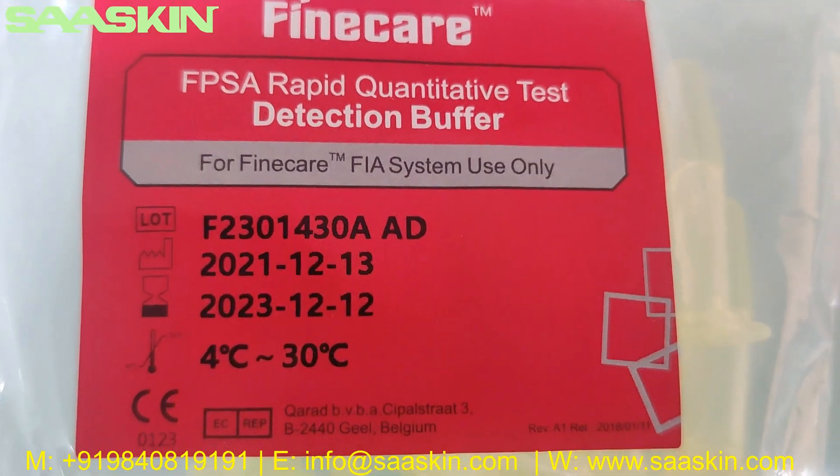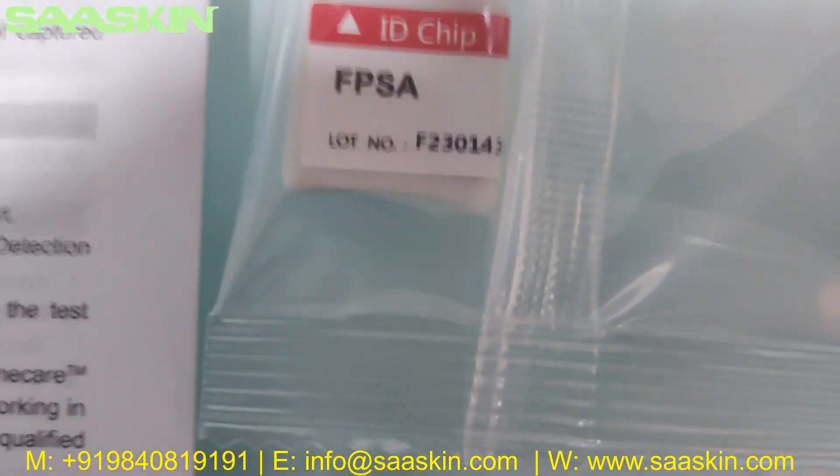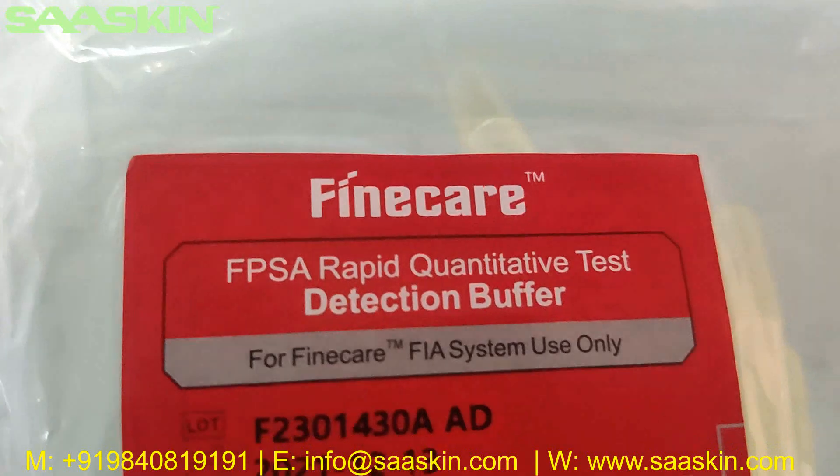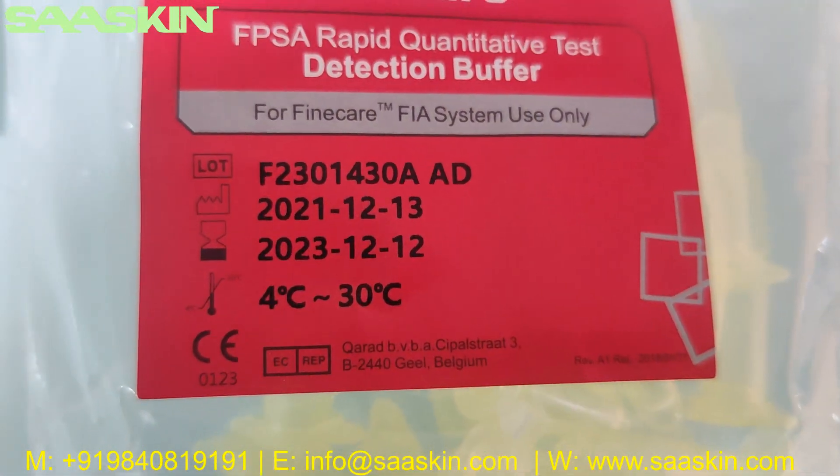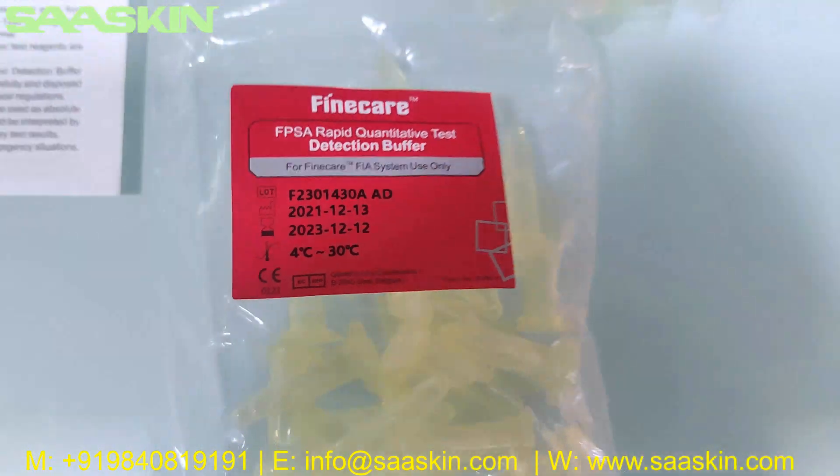Here you can see the lot number on the detection buffer, and the same lot number matches with the ID chip as well. You can also see the manufacturing date, expiry date, and the temperature range.